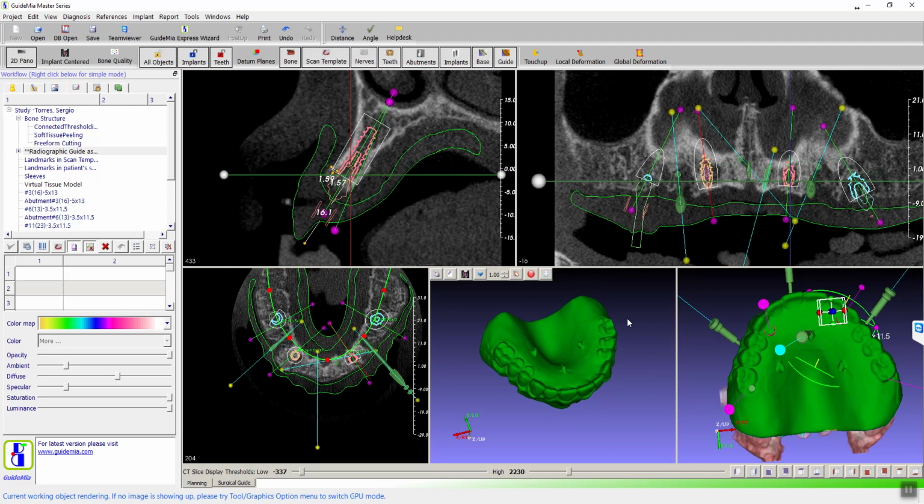At least this way, you have a way to do it here without requiring another CT scan, but it is going to require the doctor to tell you how deep the vestibule is or send you something. That's a big issue. But at least you could ride in on a white horse with this and say, you know what, doc, if you've got enough vestibule, I can bring this up 10 millimeters. Will that work? The depth of the periphery will move a little bit.